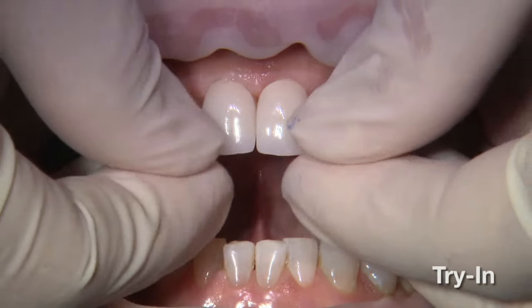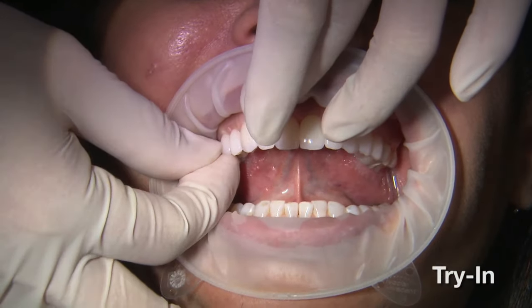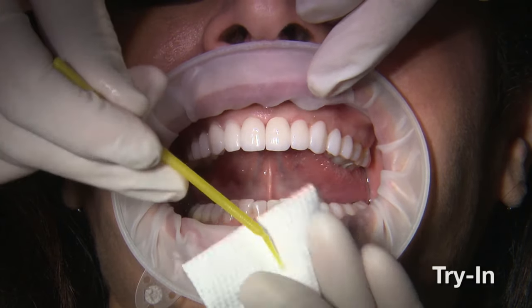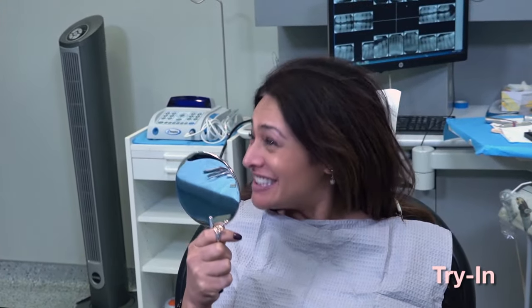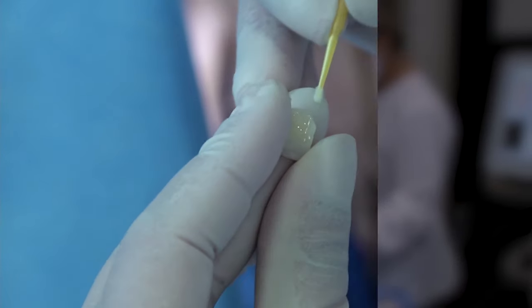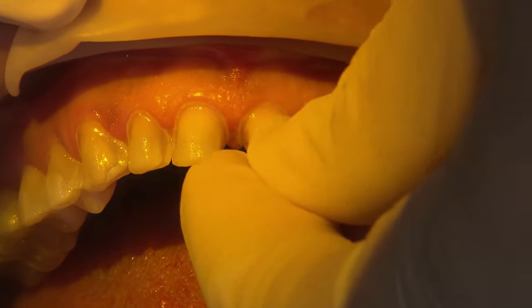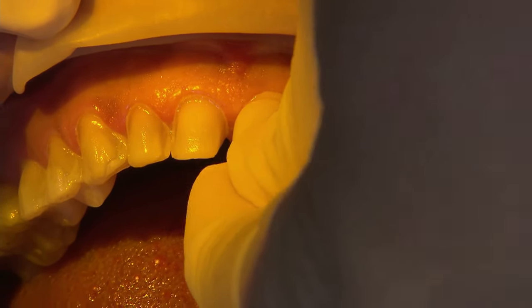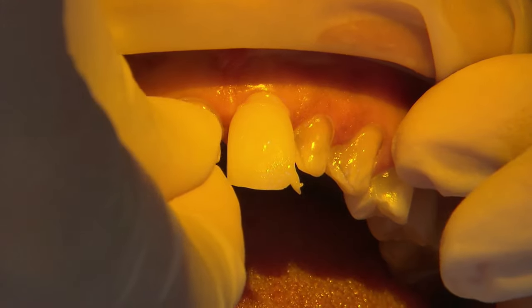Using shim stock helps determine whether the contacts are heavy — if it tears when you pull it through, try to adjust the contact down. I cut a small piece of articulating paper in the areas where the shim stock was too heavy or wouldn't drag through. Once we etch with phosphoric acid and rinse, I apply Gluma again as a desensitizer, let that soak, don't wash it off, then apply a bonding agent.